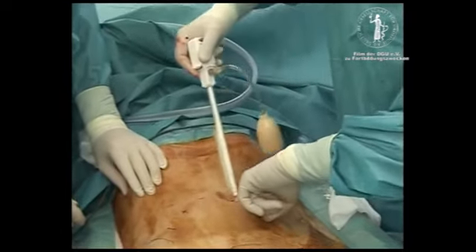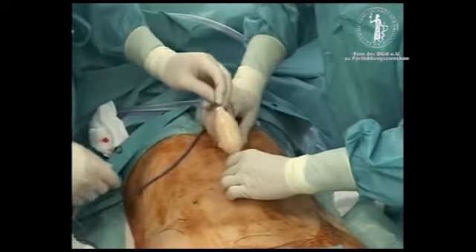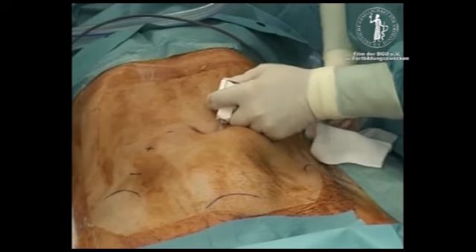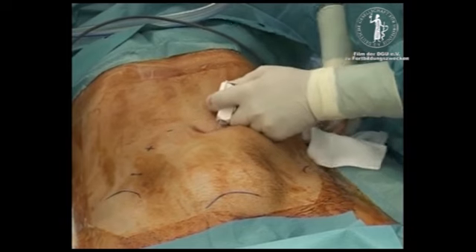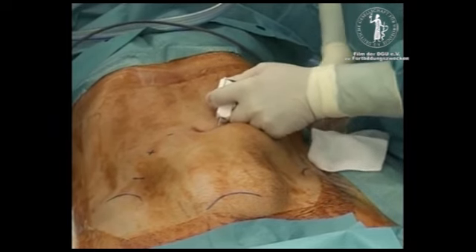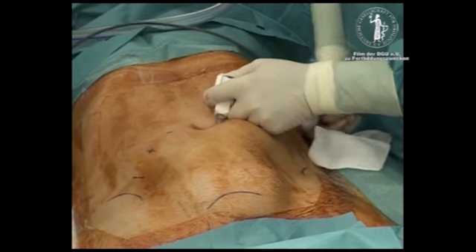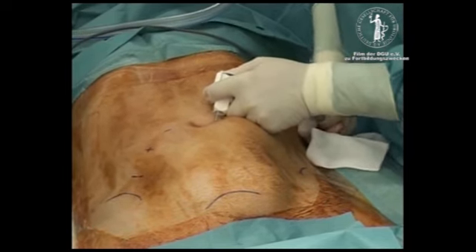This space is further developed with an inflatable balloon trocar. The balloon is filled by a hand pump until the extraperitoneal space is appropriately created. Balloon dilatation must be performed carefully to avoid bladder ruptures and peritoneal lesions, especially in cases of peritoneal adhesions.